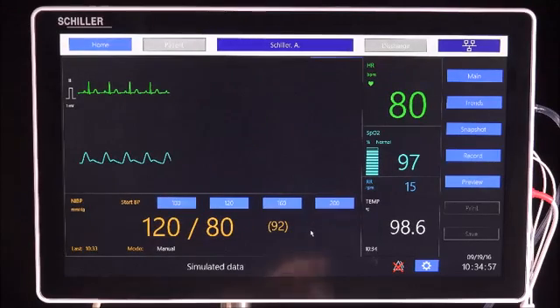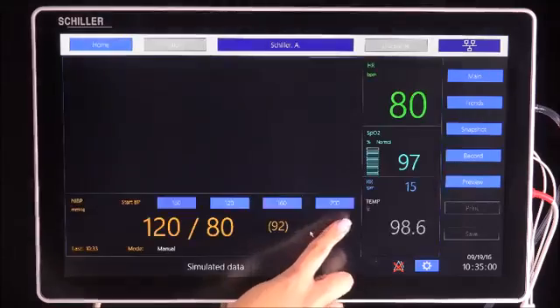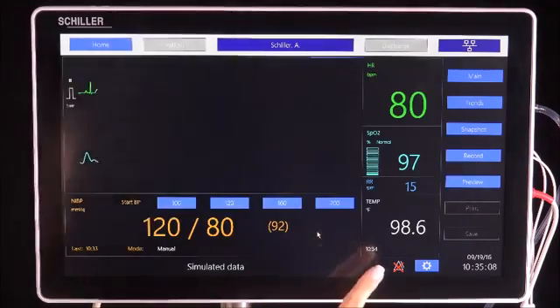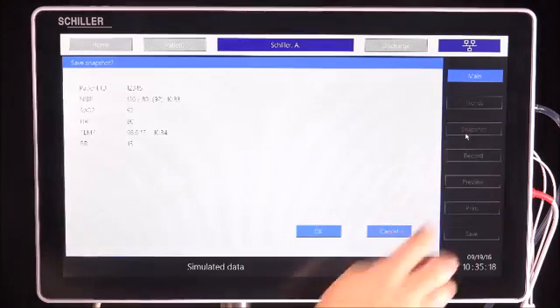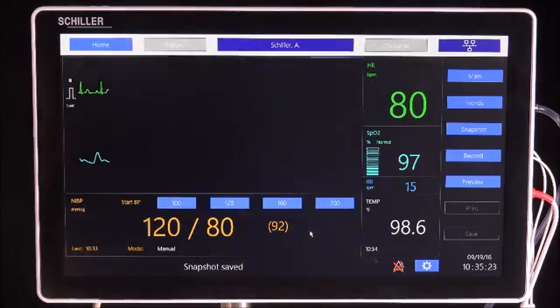On the right are the numerical values of the parameters. In order to display the setting available for each parameter, simply tap that area and the setting screen will open. By tapping the snapshot button, a snapshot of the current measurements can be taken at any time. After confirmation, the snapshot is saved and can be viewed in the trends screen.